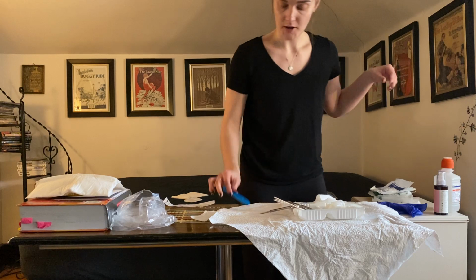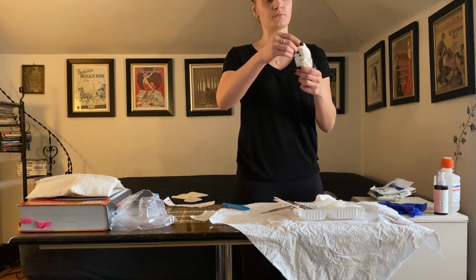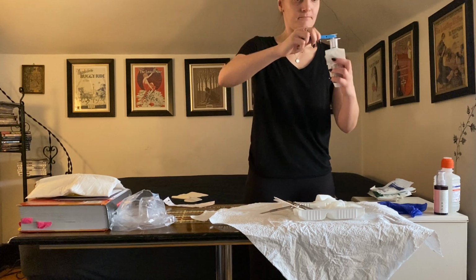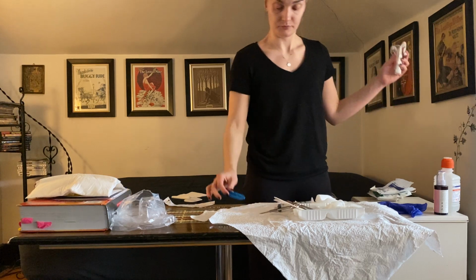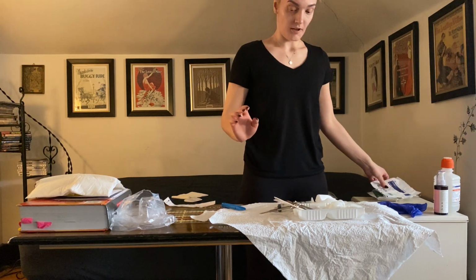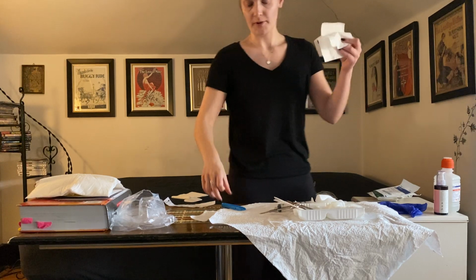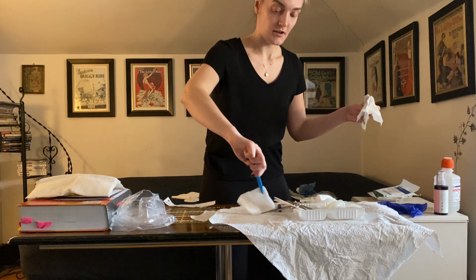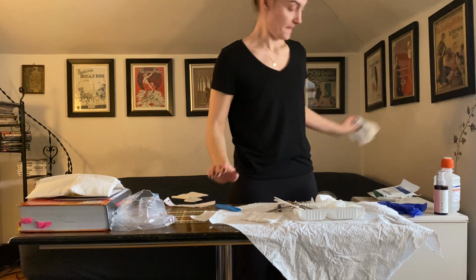once you have your sterile gloves on. Then I have my 30cc syringe here for irrigation. Okay, and so I have 2 new 4x4s because that's what I'm going to be covering the wound with after I pack it. Just being mindful of my 1-inch borders as well.